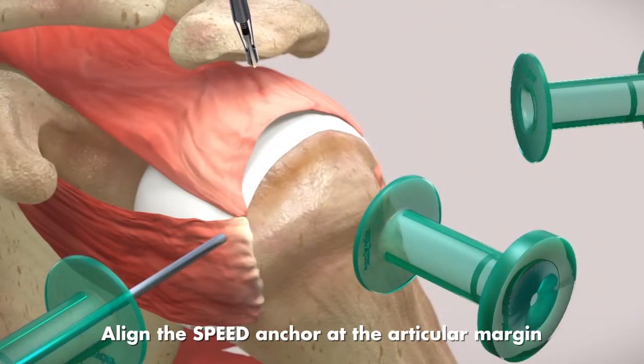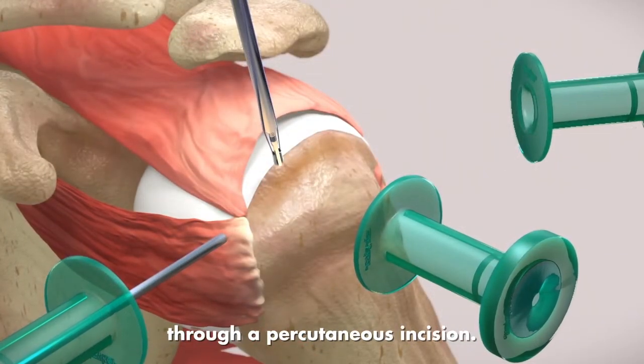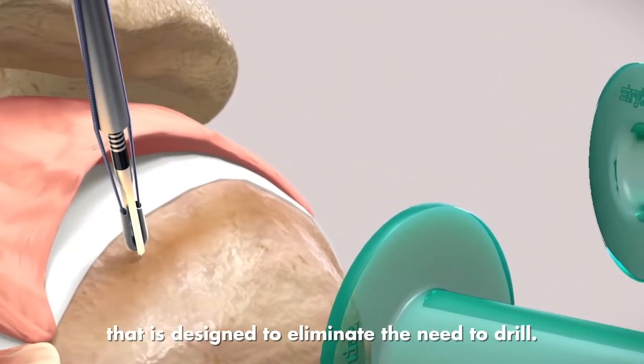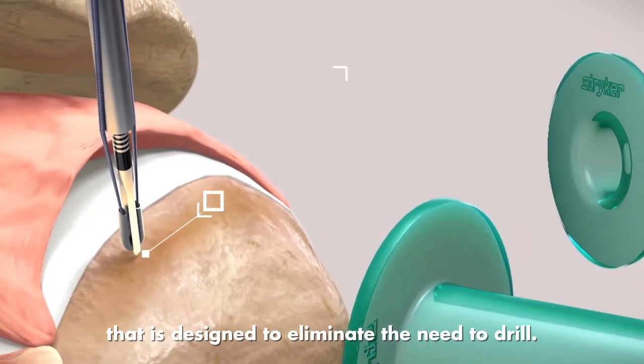Align the speed anchor at the articular margin through a percutaneous incision. The ICONICS SPEED features a self-punching trocar tip that is designed to eliminate the need to drill.